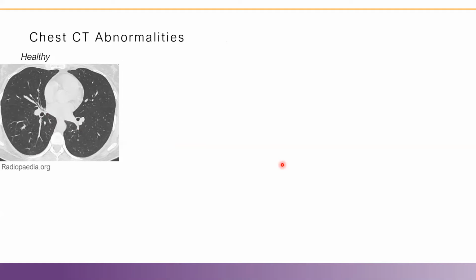And so I'm starting with chest CT. But before I do, it's important to note that actually the most common modality used to assess the burden of lung disease in COVID-19 is regular planar X-ray. And this is in both the emergency departments as well as ICU. This is because the radiation dose is extremely low, and importantly, the chest X-ray systems are portable. And so patients in the ICU, for example, typically undergo a chest X-ray every day.